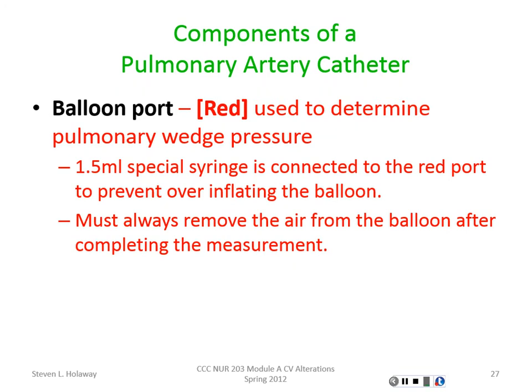Some places only allow physicians to do them because there are problems that can occur from it. Some places let especially trained critical care nurses do that. So that's going to depend on your facility. But you'll measure those wedge pressures.